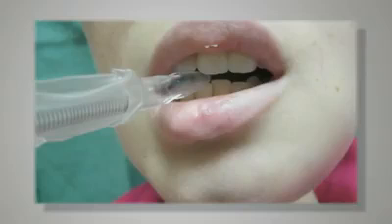However, some patients may have contraindications to nasal intubation. Tracheostomy is the last resort, but it is an invasive procedure with serious risks and complications. As an alternative to tracheostomy, we propose using the retromolar space as an entry for flexible fiberoptic oral intubation.